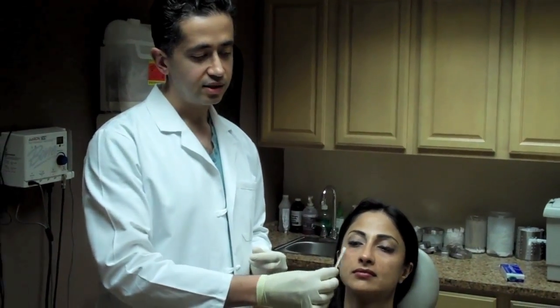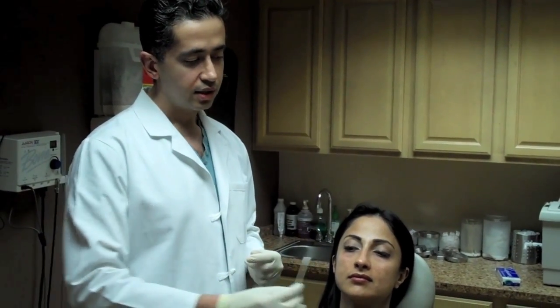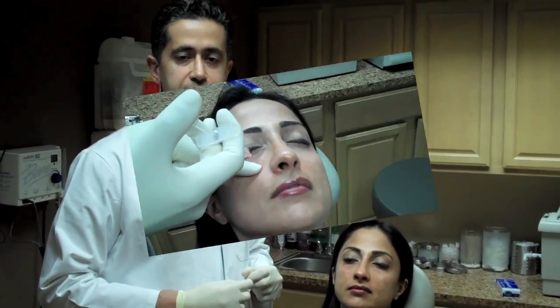I prefer Restylane, although Juvederm can also be done for the lower eyelid area. Restylane has a little bit more firmness and structural lift compared to Juvederm, and it creates less of a baggy look. So we're going to do that injection. I've applied a little bit of topical numbing for about 10 minutes. That's really all that's necessary. And I'm going to show you the injection technique now.